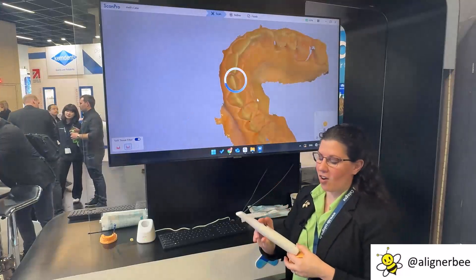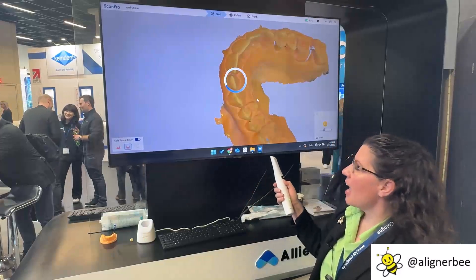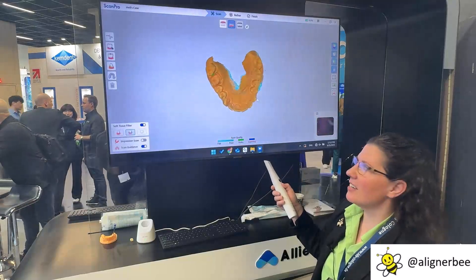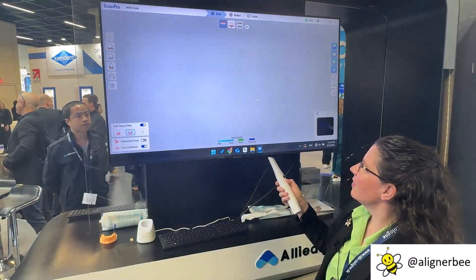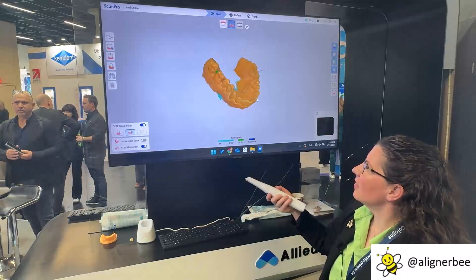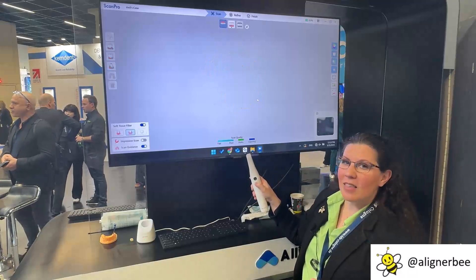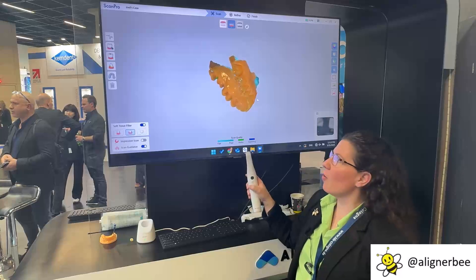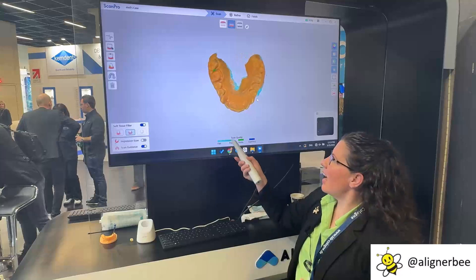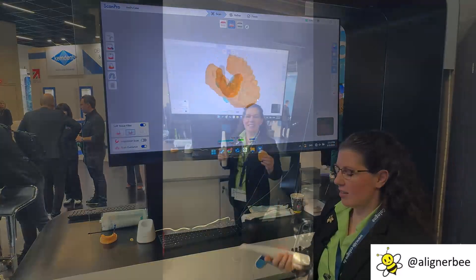When I turn the scanner off, I'm then going to press the lower button and it's going to let me control the scan on the screen so that I can inspect it. If I click the button, it's going to let me switch between the upper and lower arch, and when I'm holding the wand I can move it to activate and see the various areas on the screen.